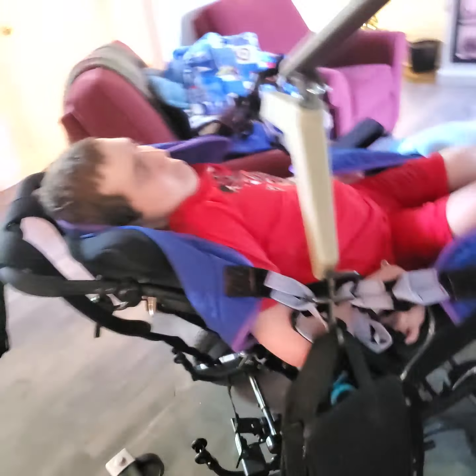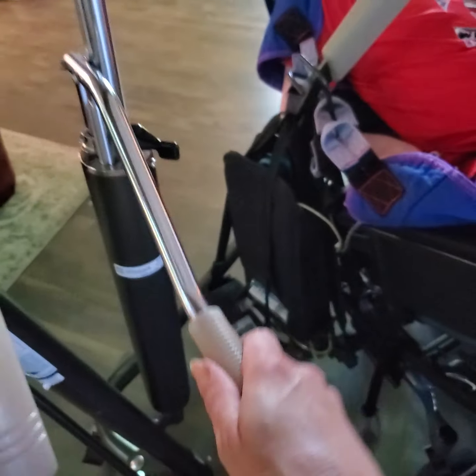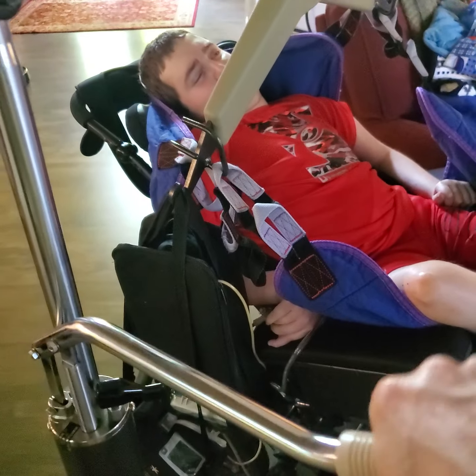And so now what we're going to do is come over here and make sure that this black lever is pushed all the way to the right. And then we're going to start pumping the handle. And as you can see, it starts lifting Jack up.